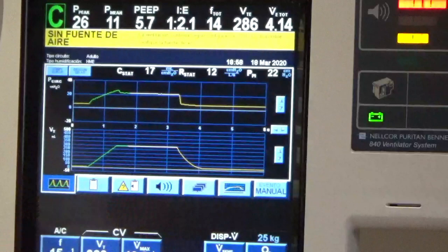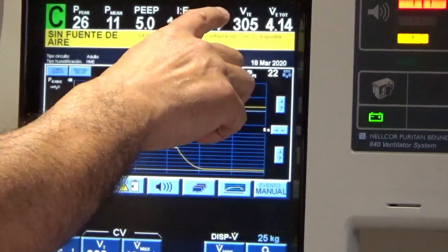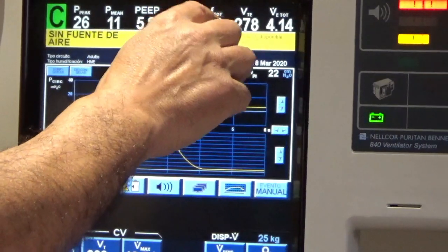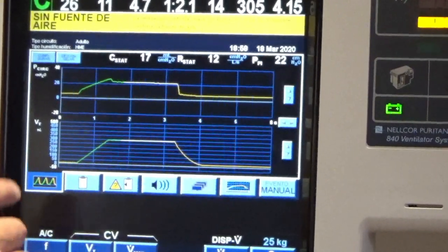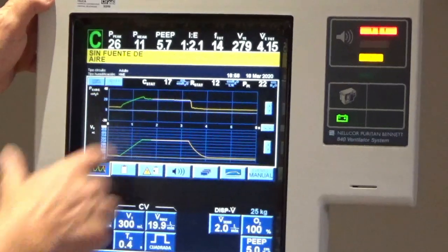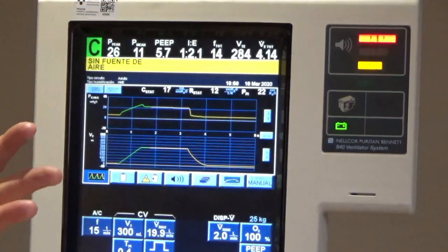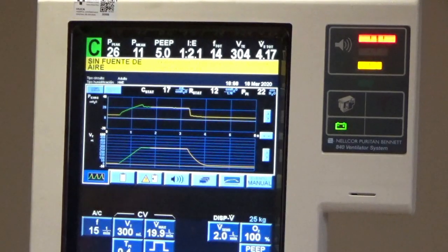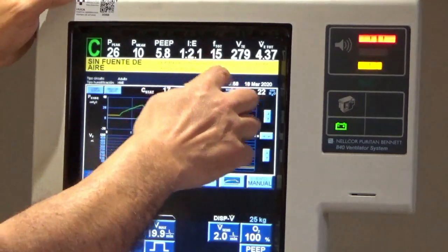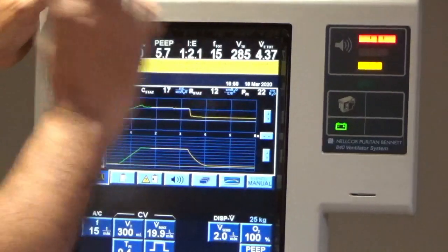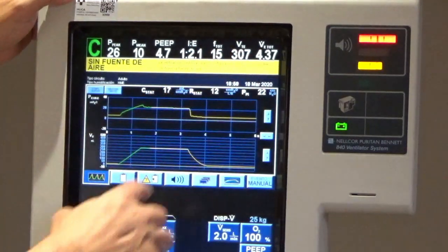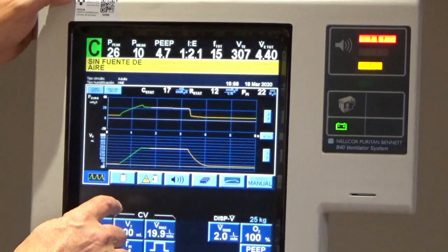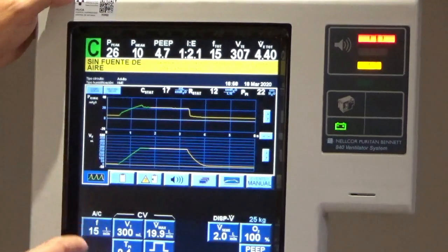Other important numbers to check include the respiratory rate — we need to compare this number with the respiratory rate previously set in the ventilator. In this case they are exactly the same, which means we don't have spontaneous breaths, assist breaths, or auto-triggering. Another important point to monitor is the expiratory tidal volume — we have to compare this with the actual tidal volume set in the ventilator.